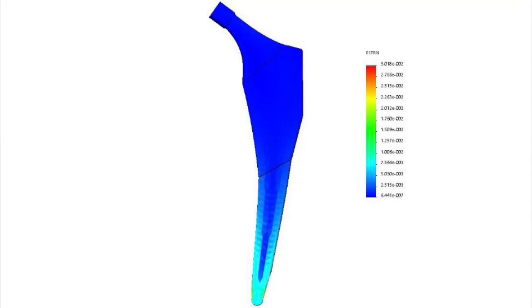In my last test, I gathered the results for stress and strain. These are two building blocks of structural analysis. They are what we use to understand where a component is in relationship to the material failure.